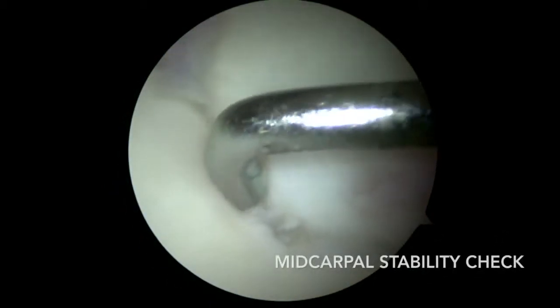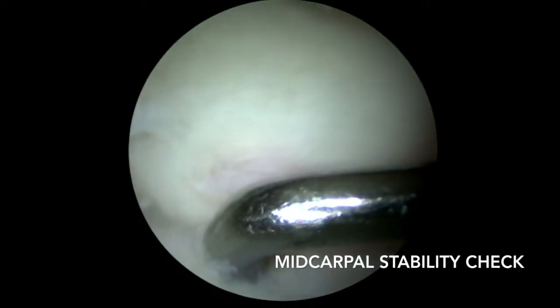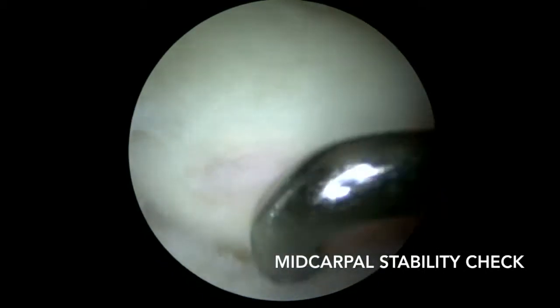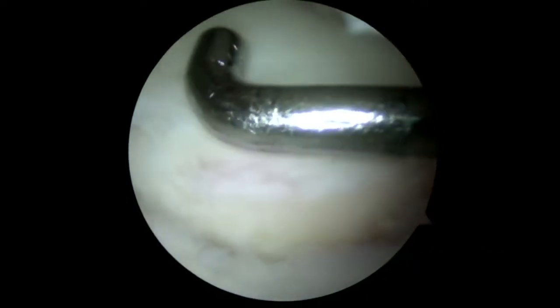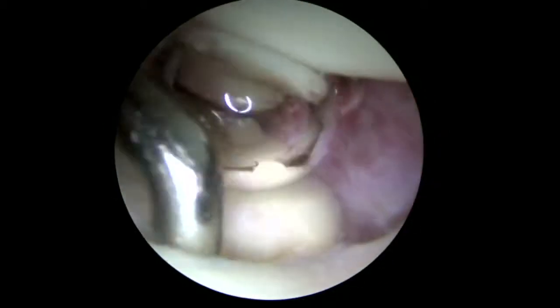Complete restoration of scapholunate joint stability is checked. First, with the arthroscope in the midcarpal ulnar portal and the probe in the midcarpal radial portal, then portals are switched. Finally, with the arthroscope in the midcarpal radial portal and the probe in the midcarpal ulnar portal, the gap is confirmed closed so the probe can no longer enter the gap.